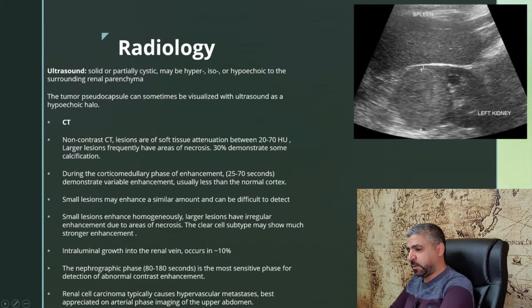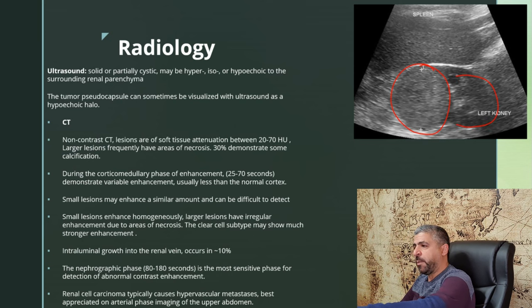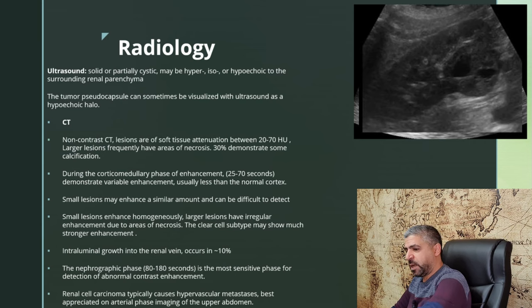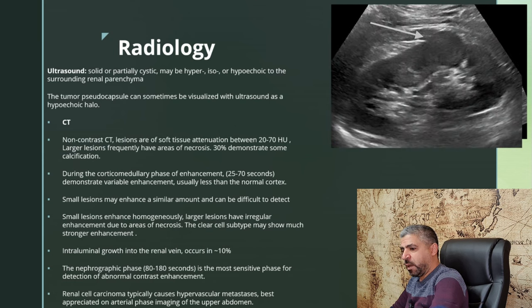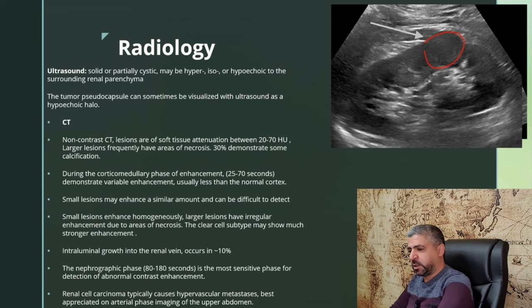They can also have cystic changes and even hemorrhage. On ultrasound, they appear as solid or partially cystic masses and can be hyperechoic, isoechoic, or even hypoechoic to the surrounding renal parenchyma. They might have a pseudo-capsule appearing as a hypoechoic halo around them. In these examples, we can see a hyperechoic renal cell carcinoma, a heterogeneously hypoechoic mass with cystic changes, and a solid hypoechoic mass in the renal cortex — all renal cell carcinoma.